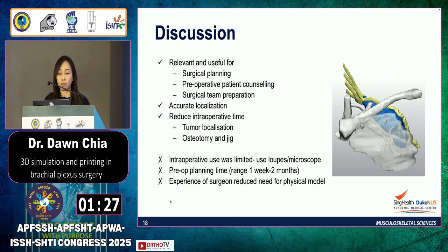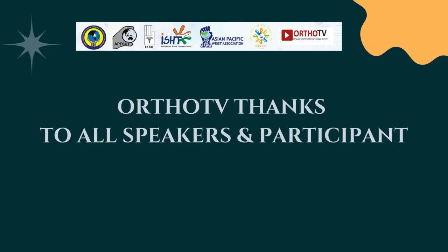The actual intraoperative function still remains limited, the main reason being we're not able to wear the augmented reality headsets while using loupes or the microscope at the same time. There is also a preoperative lag time for planning with the engineers, and it increases with the complexity of each case. It can range from 1 week for a fast case to about 2 months for the entire planning. And as with all 3D modalities, with increasing experience of the surgeon, there was also a decreasing need and usefulness for an actual printed physical model. So with this, I conclude my talk.